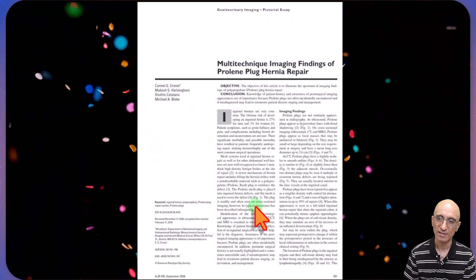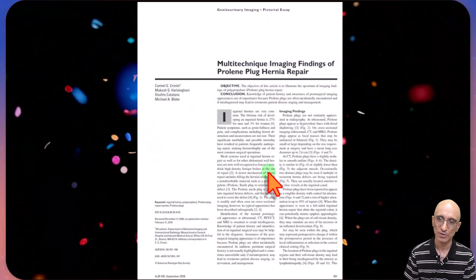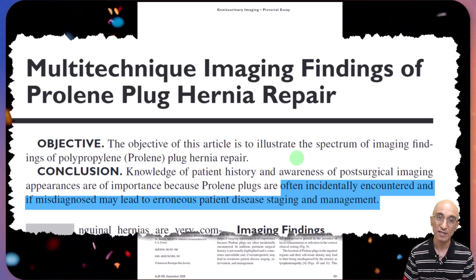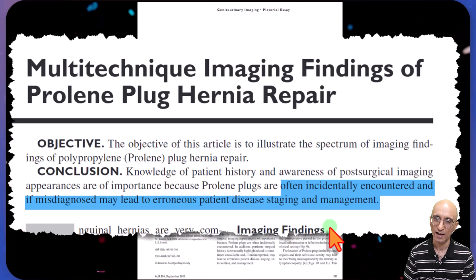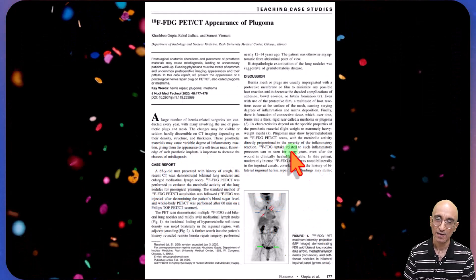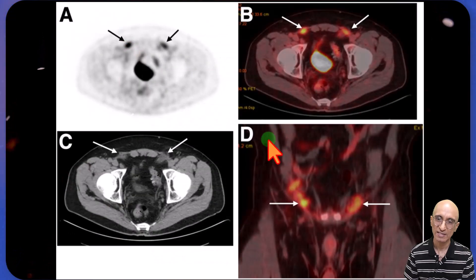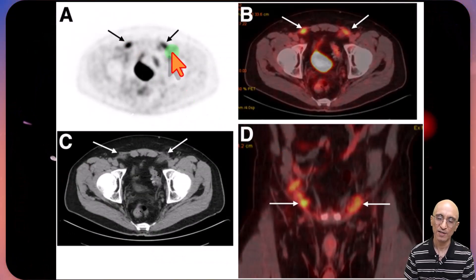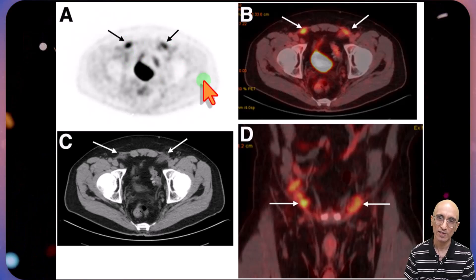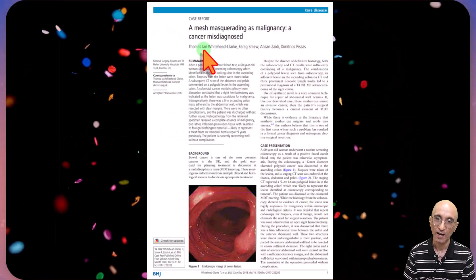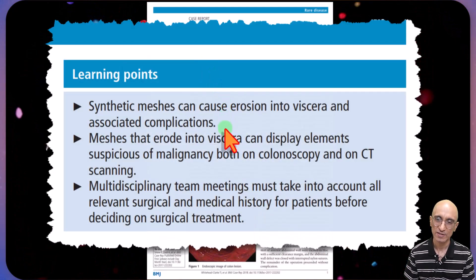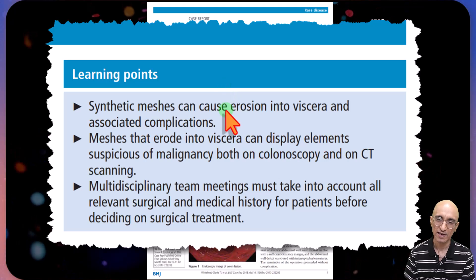This is a really nice article which you can refer to on imaging appearances of hernia mesh plugs. It is important to recognize this finding, otherwise it can be potentially mistaken for a mass. It is also important to remember that these lesions can be avid on FDG PET, which can further mislead the radiologist into calling these mass lesions. Very rarely, these lesions can also erode the adjacent viscera, as described in this case report.